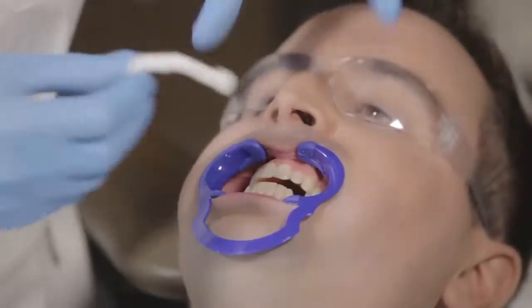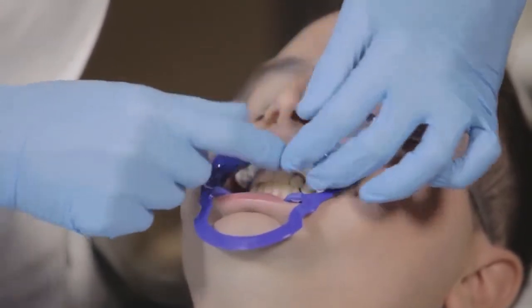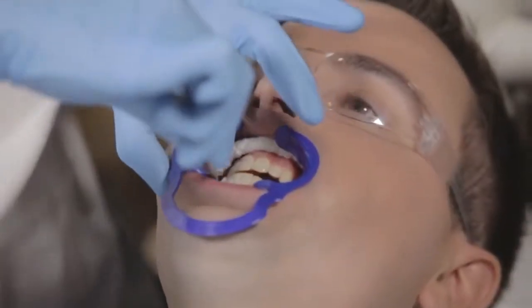If needed, insert the provided cotton rolls into the patient's vestibule areas, taking care to tuck the corners in completely. Two rolls are provided in each patient kit — one for the upper and one for the lower.